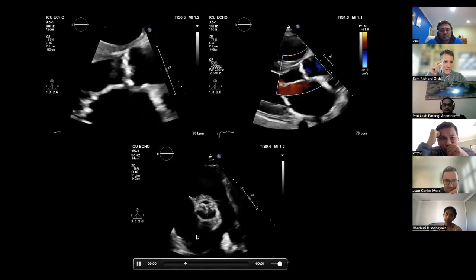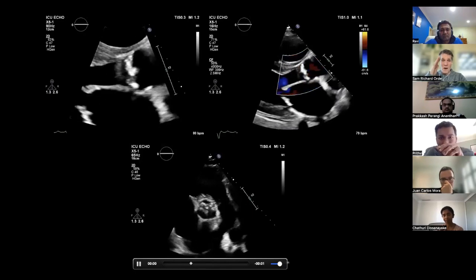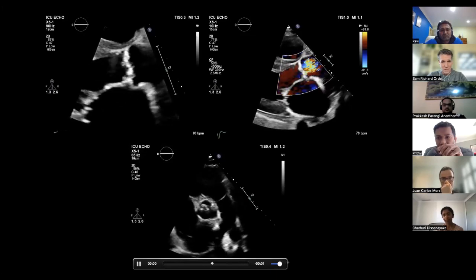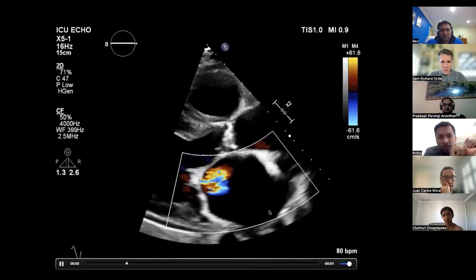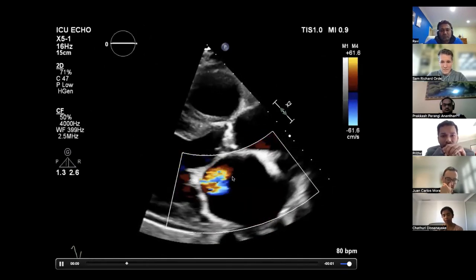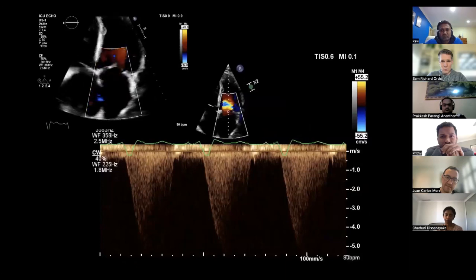So again, that's with the regional wall. Don't be great with all that chat and then fail the case because you said they were looking at the inferoseptal wall and it's the anteroseptal or something. Totally agree with that. Raised left atrial pressure from a terrible LV. That's probably underestimated. Then I think you said all that. Severe TR, very nice, triangular shape. Don't worry about that. That was all nice.